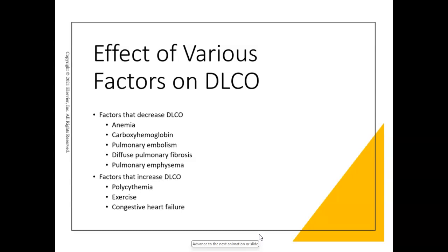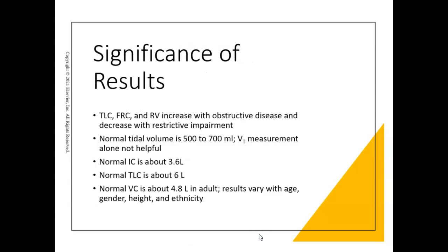With this procedure, you want to make sure that the patient is resting in a seated position and hasn't been running a mile right before they did this. You also want to make sure that they're not breathing any supplemental oxygen before the test. Usually we withhold that for about 10 minutes before testing.